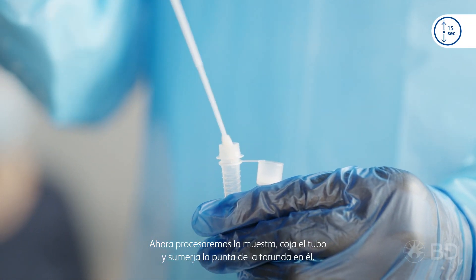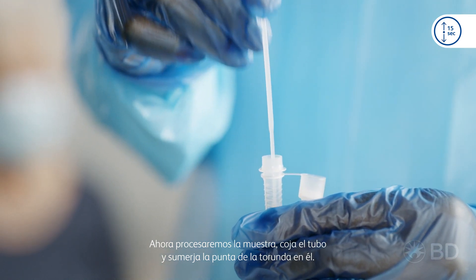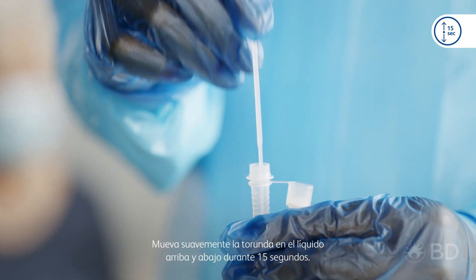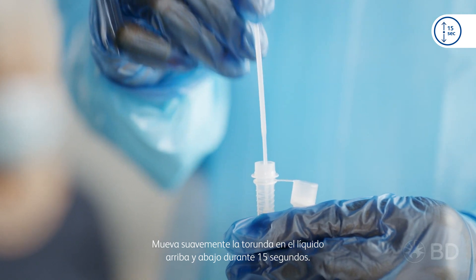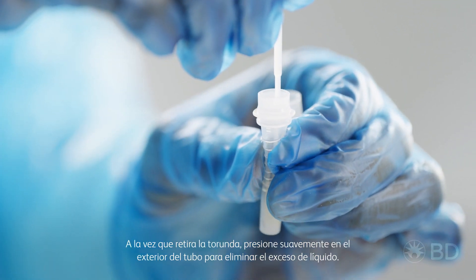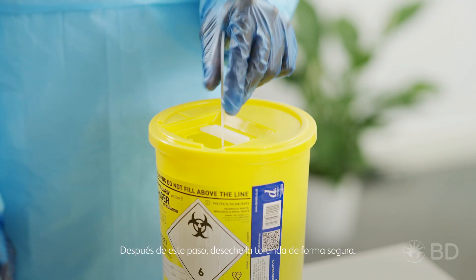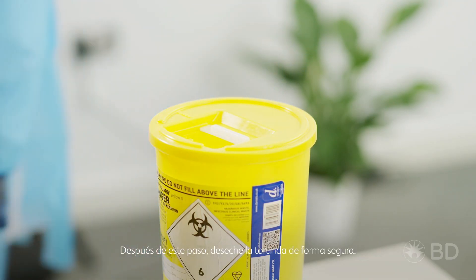Now it's time to process the swab sample. Pick up the tube and dip the tip of the swab in. Gently move it up and down in the liquid for 15 seconds. While removing the swab, pinch slightly on the outside of the tube to remove excess liquid. After this, dispose of the swab securely.